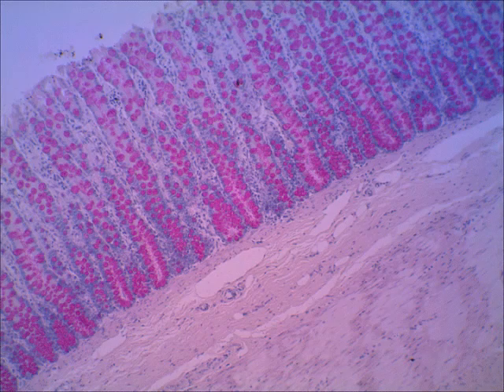It doesn't even have to be stained to show the goblet cells. If you just saw a straight tube that had a ton of holes in it, those holes would be where the mucus was. Okay, so here you can see all these pink dots that you see. That's the stained mucus of the goblet cells that line the tubular mucus glands that are so prevalent in the mucosa of the large intestine. So this one's very easy to recognize.